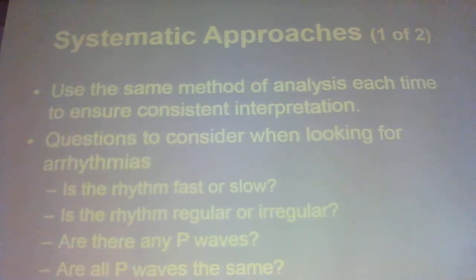So how do you know if something's anatomically contiguous? One, it has the same name. So like 2, 3, and F are inferior leads. 1 and AVL, V5 and V6 are lateral leads. V1 and V2 are septal leads. V3 and V4 are anterior leads.